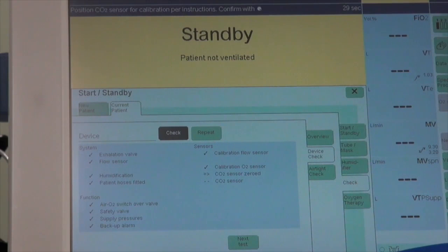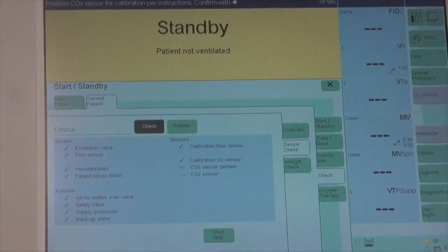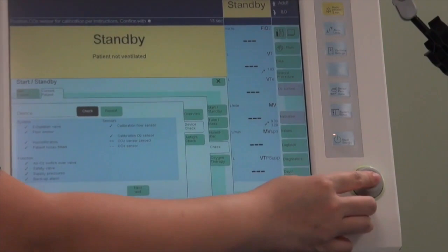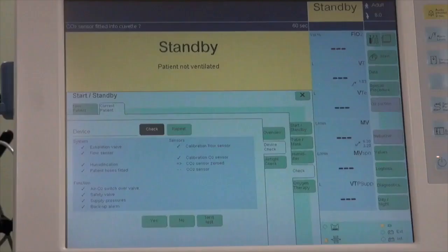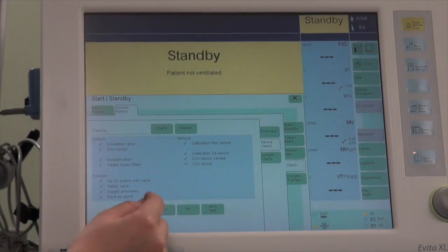Now we are doing the sensors check. Position the CO2 sensor for calibration per instructions and confirm with the rotary knob logo. Once it's fitted into the calibration port, confirm. Then perform CO2 zero calibration with the CO2 sensor fitted into the cuvette at the side of the ventilator, and click Yes.